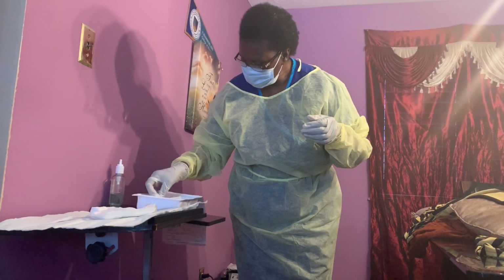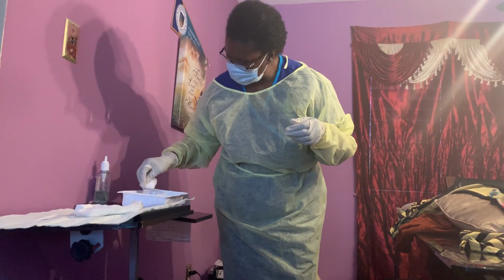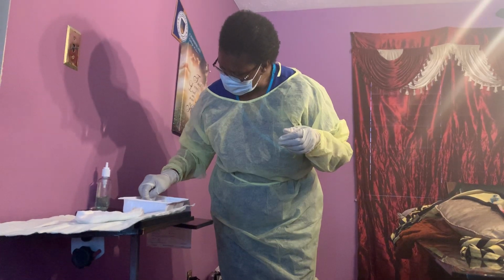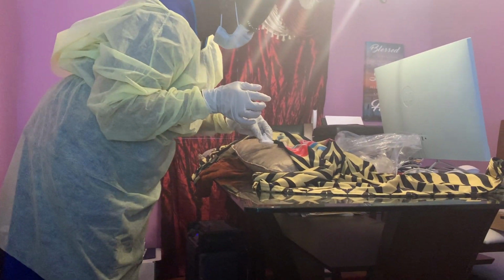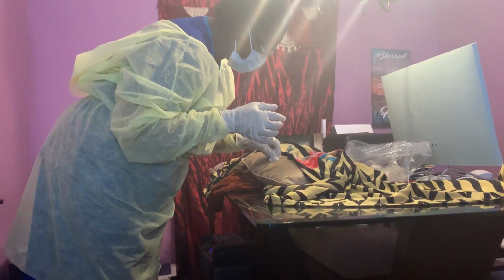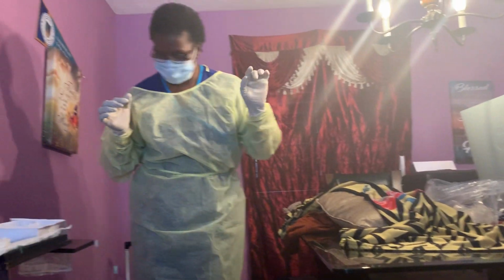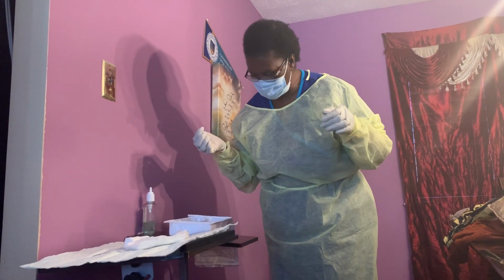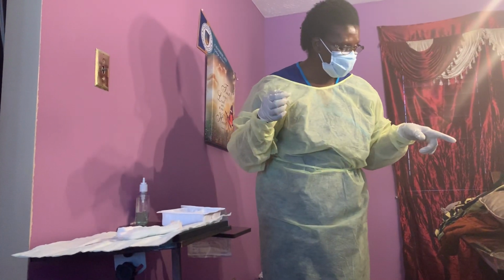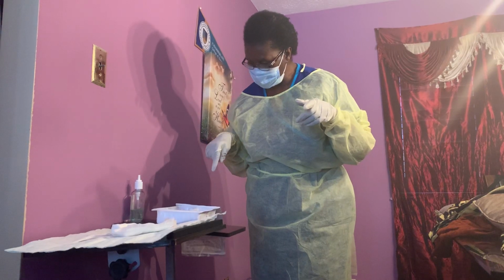And take another one, soak, squeeze, pass it to the clean hand, and continue from where I stopped inside, and trash. Make sure I do just one and clean one way and one time, not going back and forth. Now that is done, I need to do my packing. So my gauze has been pre-packed.